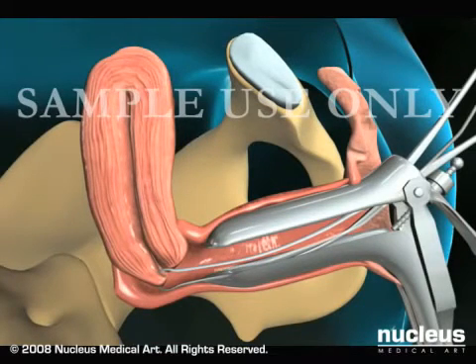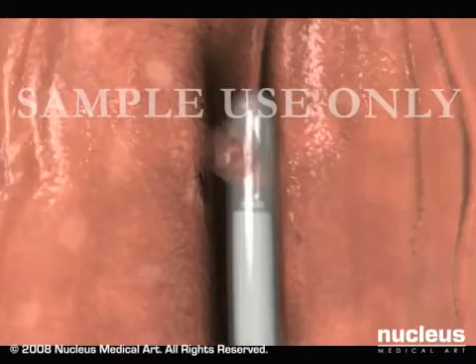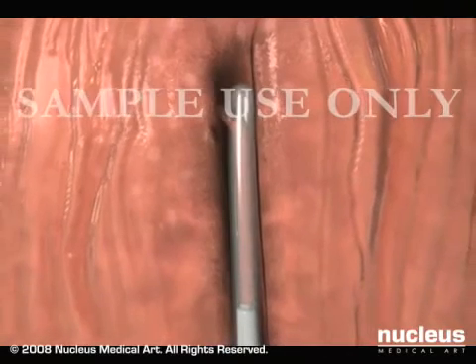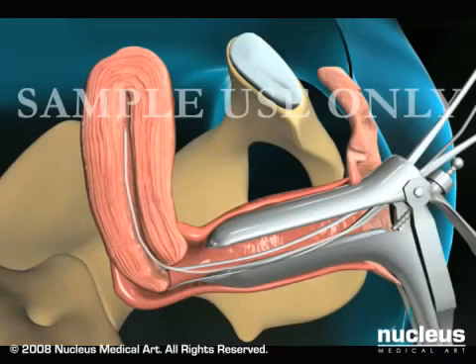Your doctor will then pass a long, thin, flexible tube called a pipel through your vagina and cervix and into your uterus. The pipel is equipped with a piston-like device that creates suction when pulled. Your doctor will spin the pipel and move it up and down in the uterus while suctioning up an adequate sample of endometrial tissue.